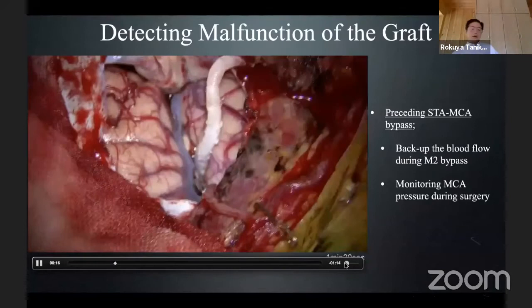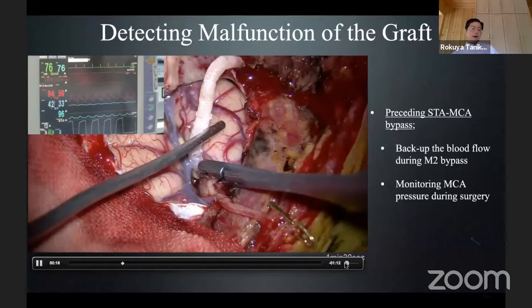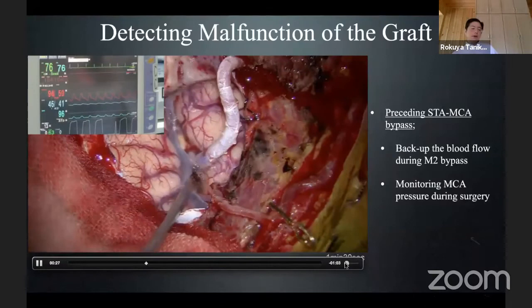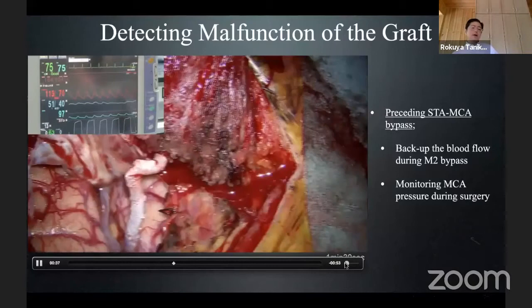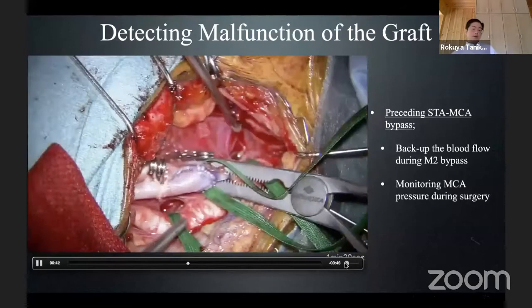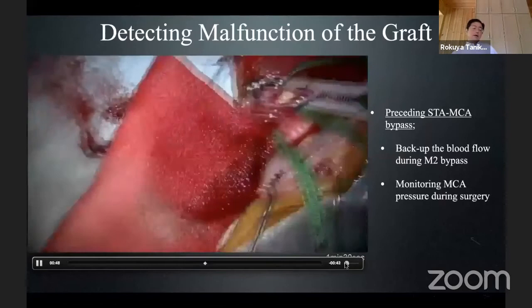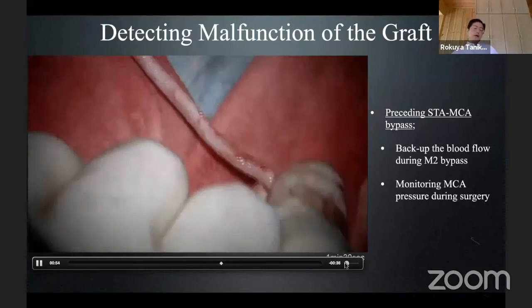After high-flow bypass ICA clamp, MCA pressure declined. Now the graft is opened — MCA pressure is 30 mmHg. By opening the graft, it is slightly elevated to 42–43 mmHg. I am feeling the pulsation — no pulsation. You can see 180-degree twisting of the graft. This was the cause of the graft malfunction. MCA pressure monitoring is very sensitive to this kind of complication.